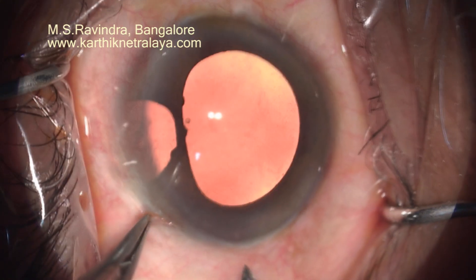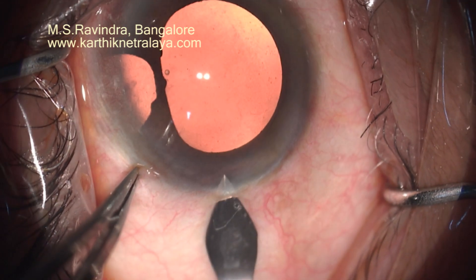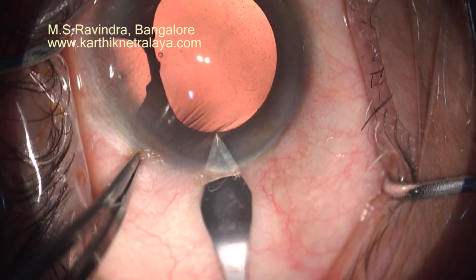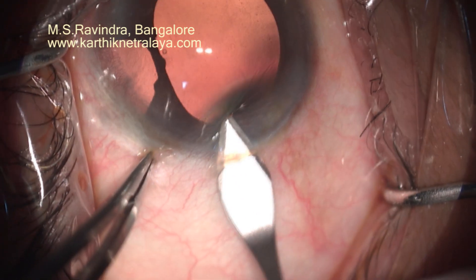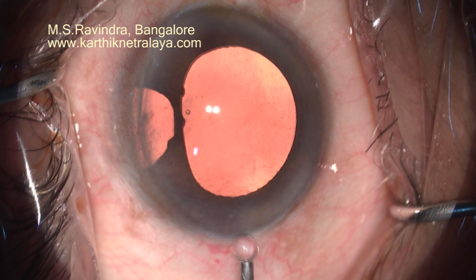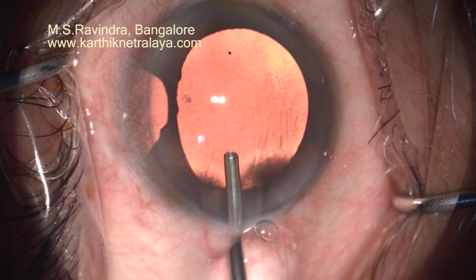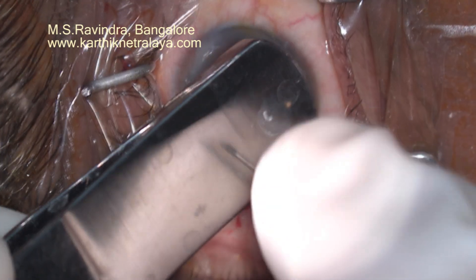Long-standing glaucoma. Trabeculectomy was done with a large PI about 35 years ago. Patient had a large against-the-rule astigmatism at the steep axis at 3 to 9 o'clock.